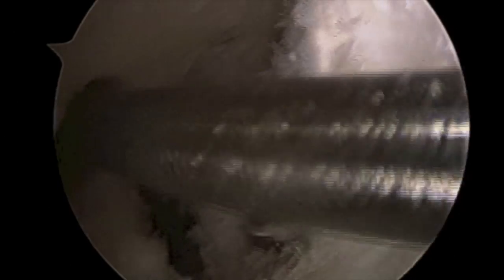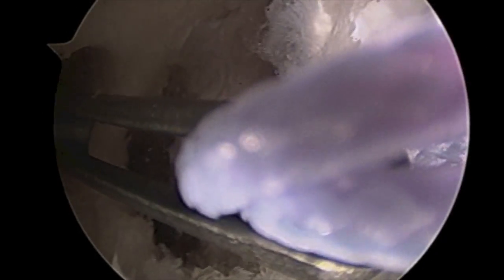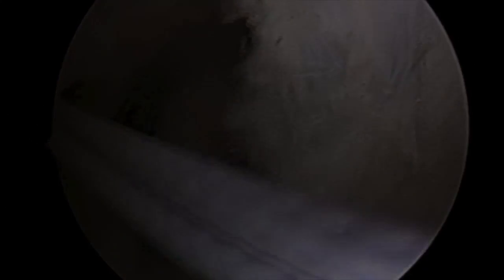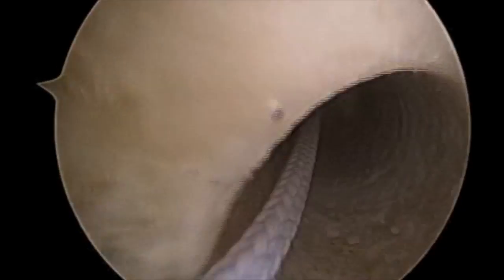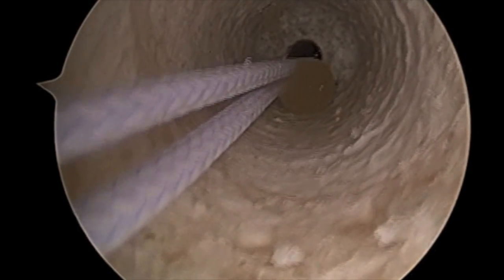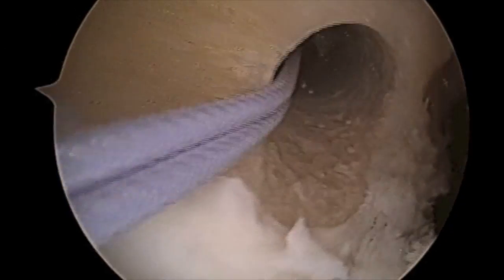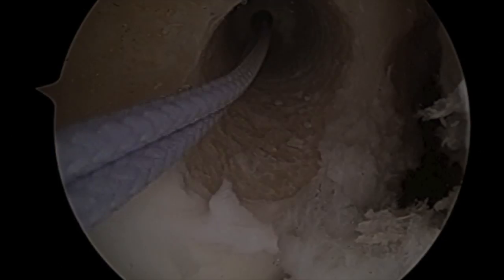A shuttling suture is then passed into the joint using the previously placed flexible guide pin. Switching the arthroscope to the medial portal allows visualization of the femoral tunnel to ensure that no back wall blowout has been performed and that the tunnel is in appropriate anatomic position.